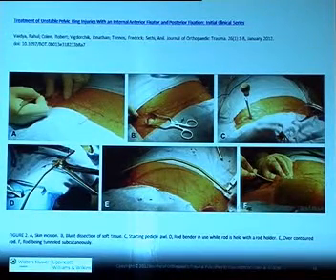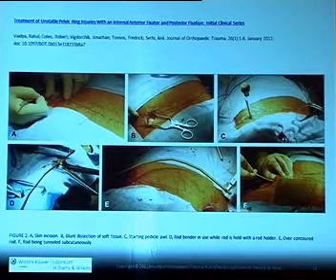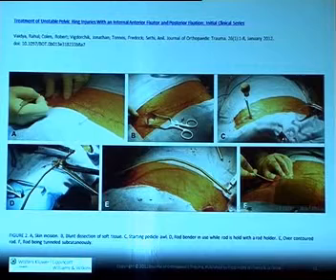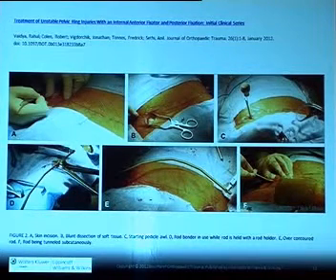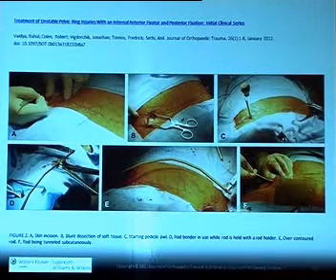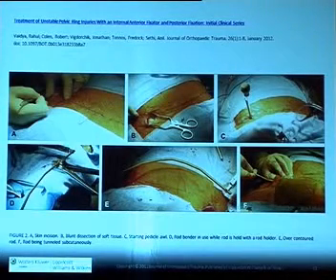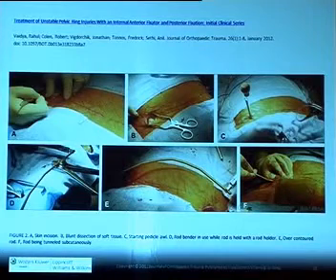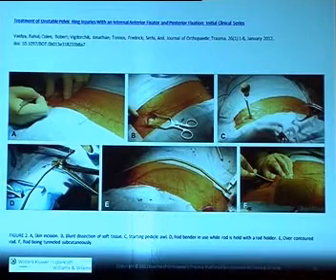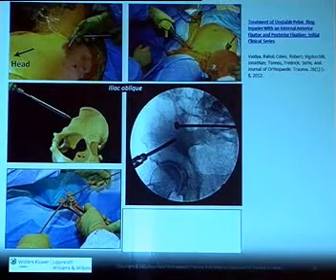So in picture A, there's a skin incision probably about 1 inch in line with the axis of the screw through the anterior inferior spine. Dissect down to the inferior spine, incise the fascia, and place your screw along the sciatic buttress. Then you're going to make a tunnel with your pre-bent bar. It's a 6 millimeter bar in most cases. Apply it through the subcutaneous tunnel beneath the skin, and you can feel your way across as you apply it. Attach it to the pedicle screw grommets and cinch the whole thing down while doing a reduction. And this is a summary slide going through those individual parts.